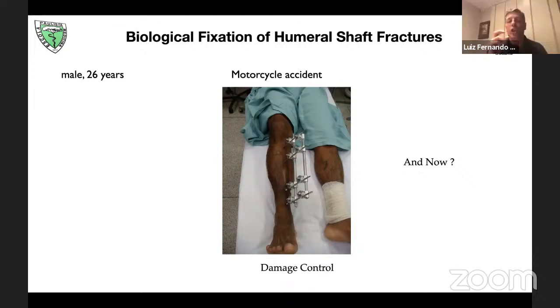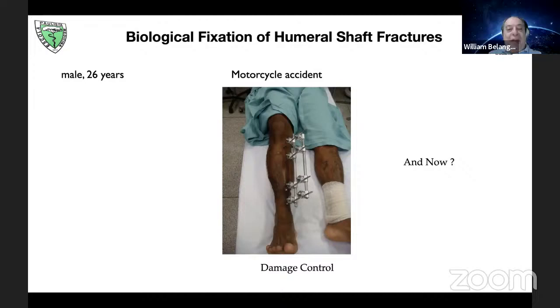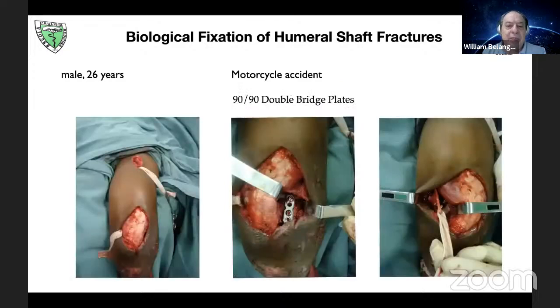Okay. But what changed your mind? Definitely it's better to see, of course, but what could you change if you have a small fragment? I think that even in this situation, you can do an anterior bridge plate using the distal lateral column of the humerus. Then you can put at least 2 screws in the distal fragment. Then you extend the plate, but to do this, you need to make a twist in the plate, more or less 20 degrees, twist the plate and mold the distal part of the plate. This is another option. No, I like this option very much. Yes, this is one option. This is the posterior approach. Right.